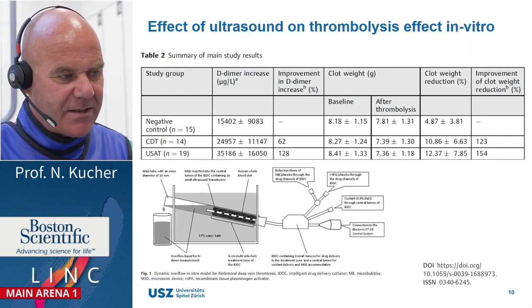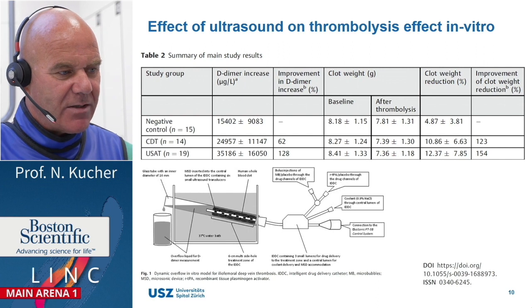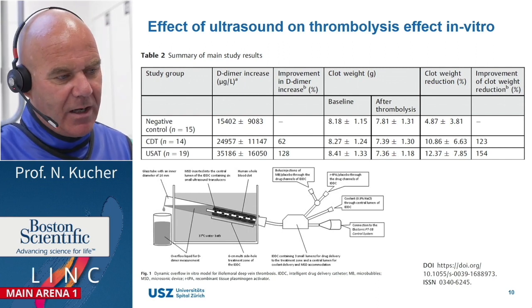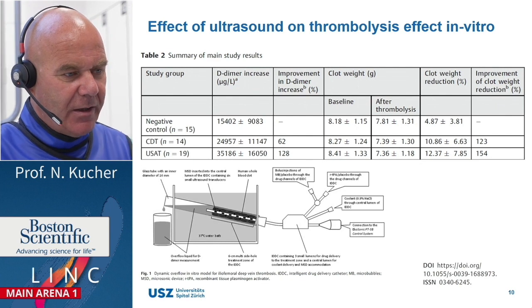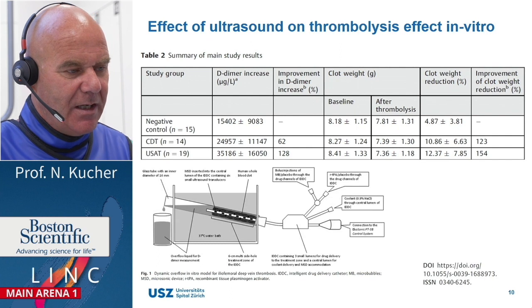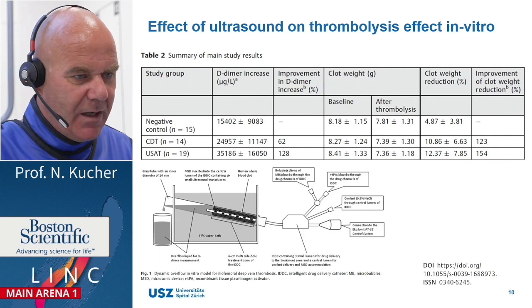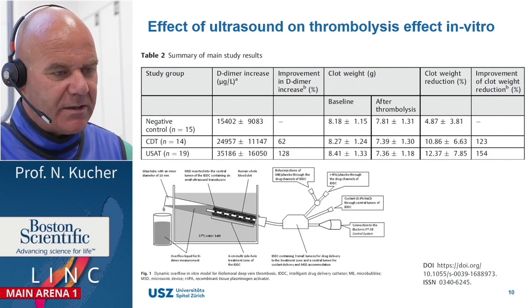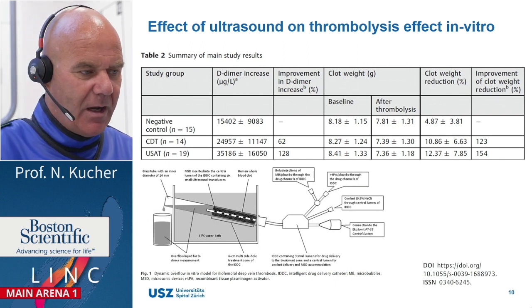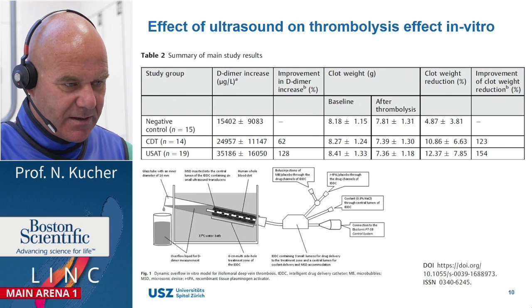What you can see is when you compare the last two lines, CDT where the ultrasound was switched off versus the USAT where the ultrasound was switched on, we clearly had much higher D-dimer levels in the USAT group, and we also had a more significant reduction in clot weight during ultrasound-assisted thrombolysis. Next slide, please.